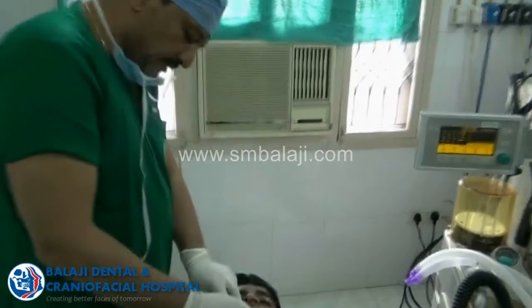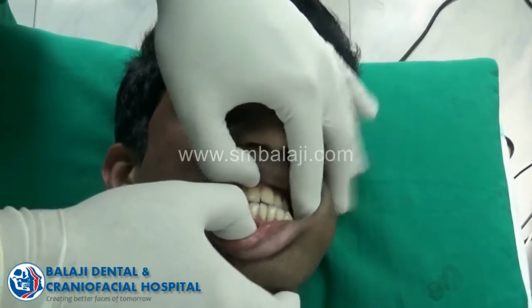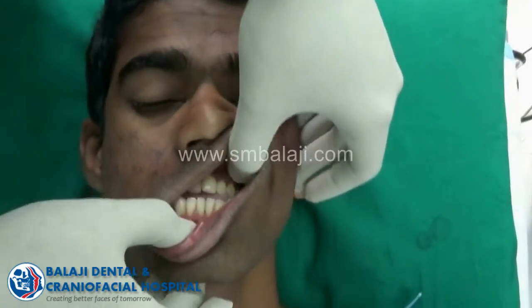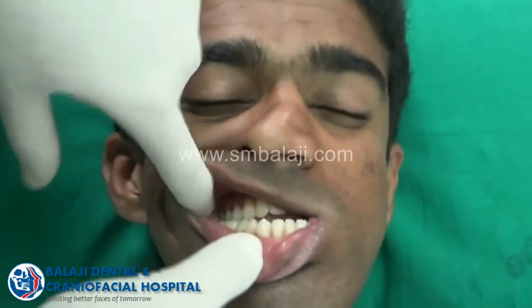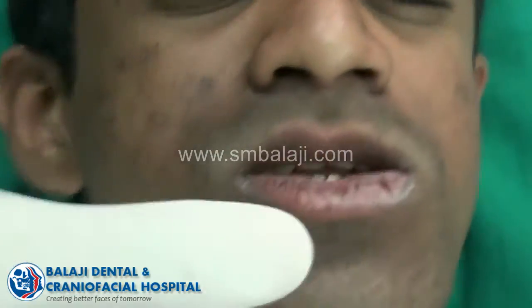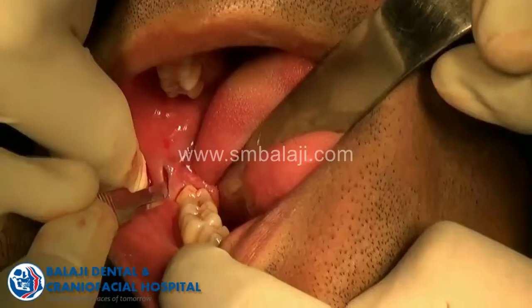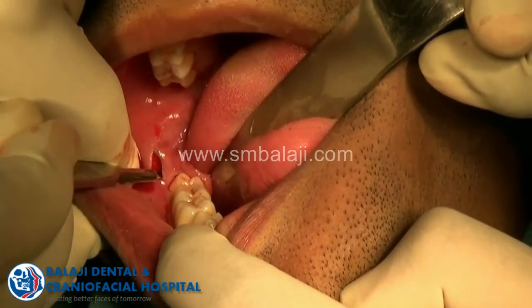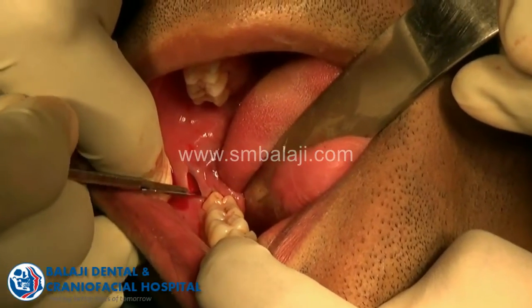This boy is a case of mandibular prognathism. You can see the occlusion Class 3 with the prognathic mandible. My plan is to do a mandibular setback by doing a bilateral sagittal split osteotomy. You can see me exposing the mandible.